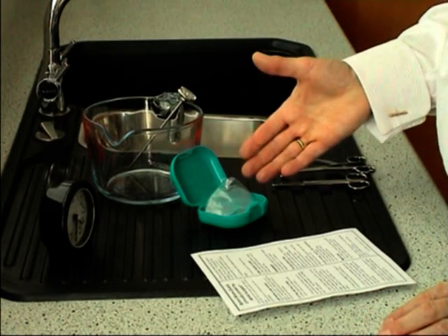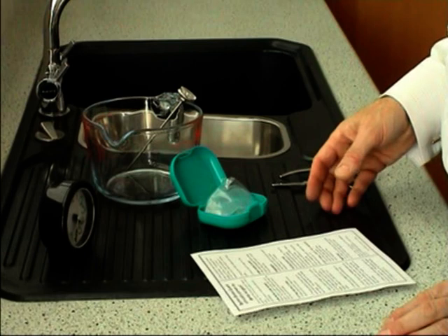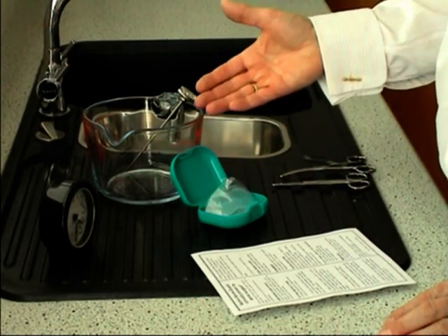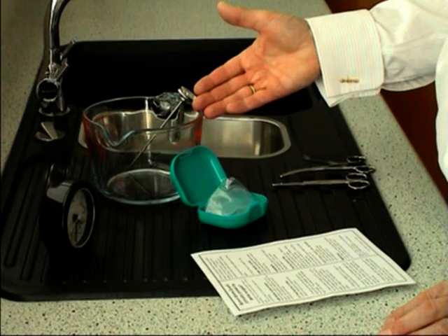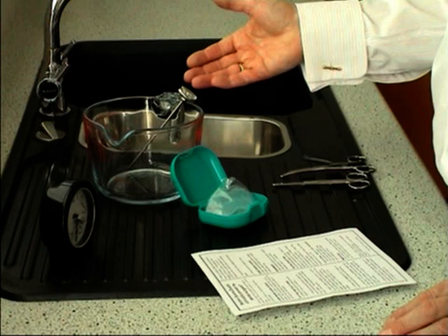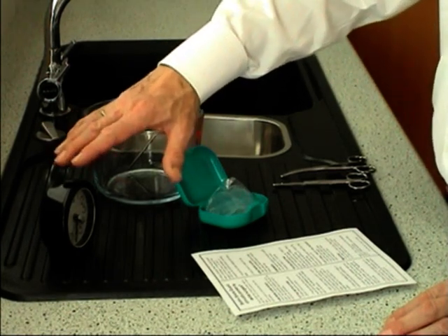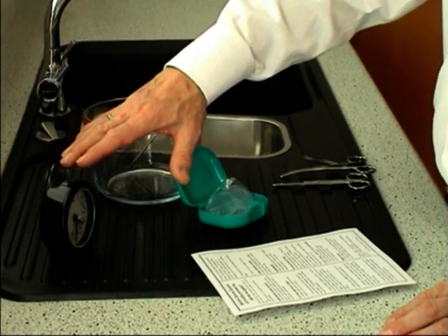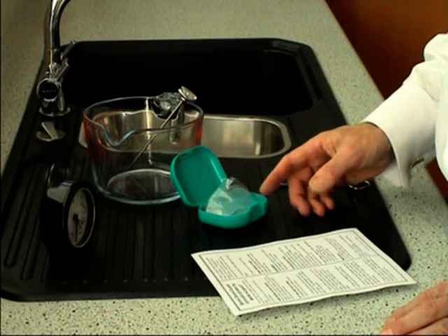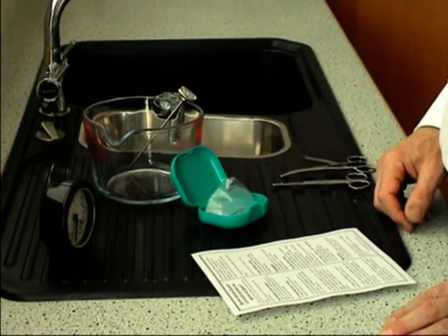I'd like to show you how quickly and easily you can mould a Somni Snore Guard. You'll need the Somni Snore Guard, a jug or bowl to put your water in, possibly a thermometer if you've got one that will read 65°C, but it's not necessary. But you absolutely must have a clock or a watch that has a sweep second hand, because it's very important that the device is immersed in water for one minute exactly. And you'll need something to hook it out with.